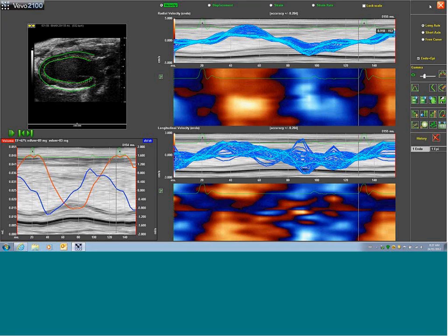Okay, good. There's another question that's just come in about the depth of anesthesia and what effect that has on the strain and strain rate. Right. Anytime you're capturing your images, you'll want to have the physiological conditions as normal as possible. Keeping your heart rate between 500 and 600 beats per minute is good. As the animal becomes deeper in anesthesia, that will affect cardiac function. So try to keep your anesthesia at a point at which the animal is as close to physiological conditions as possible.